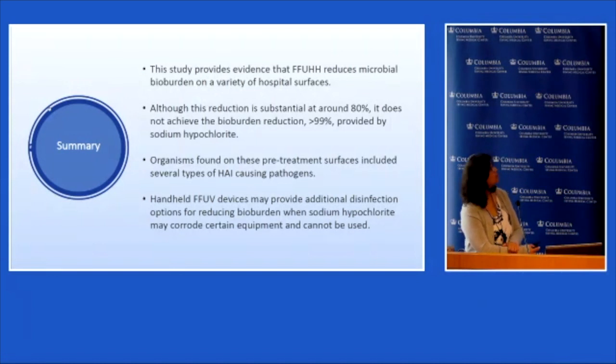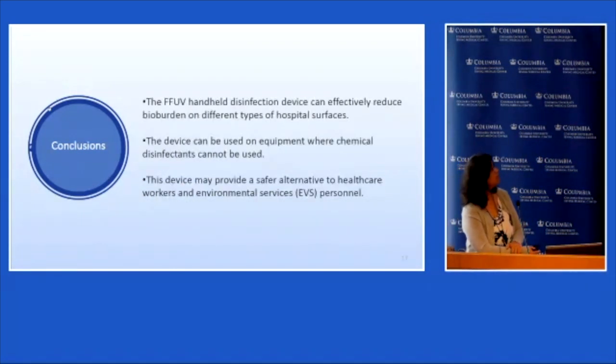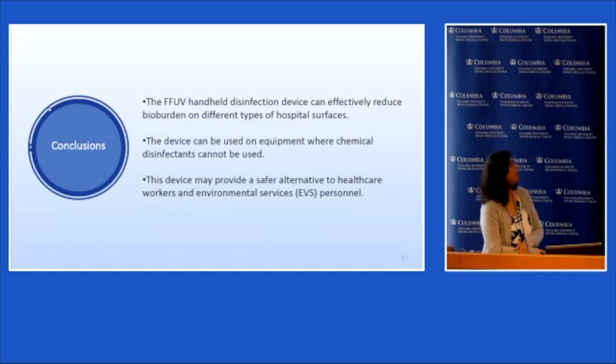And finally, the three takeaways from the talk today are that this device can effectively reduce the bioburden on different types of surfaces. And this can be used on some sensitive medical equipment where you cannot use sodium hypochlorite. And last but not least, this device may provide a safer alternative for the healthcare workers as well as the environmental services personnel.